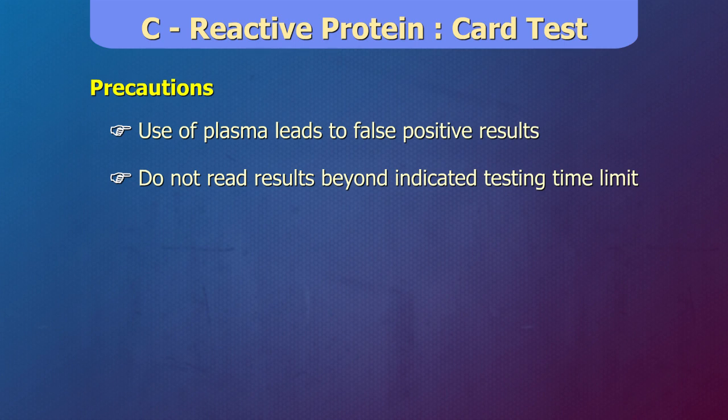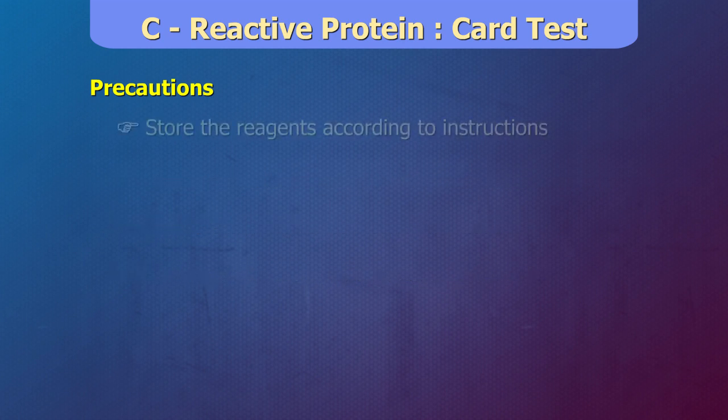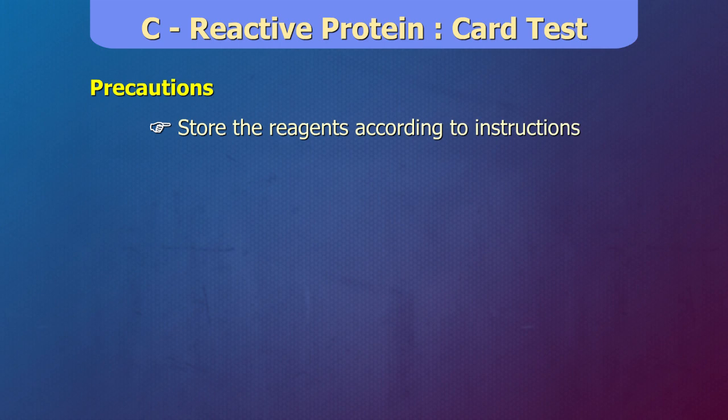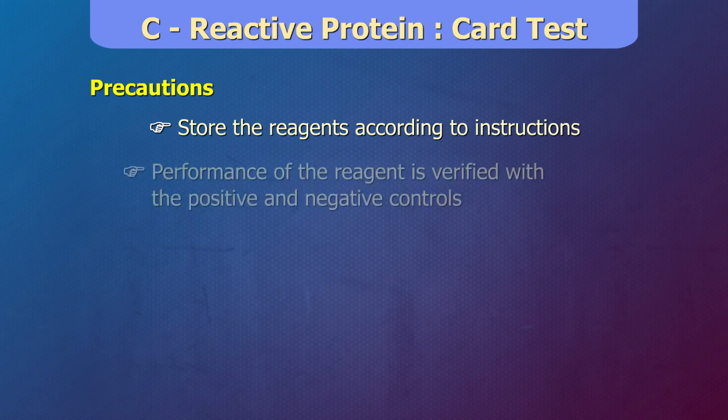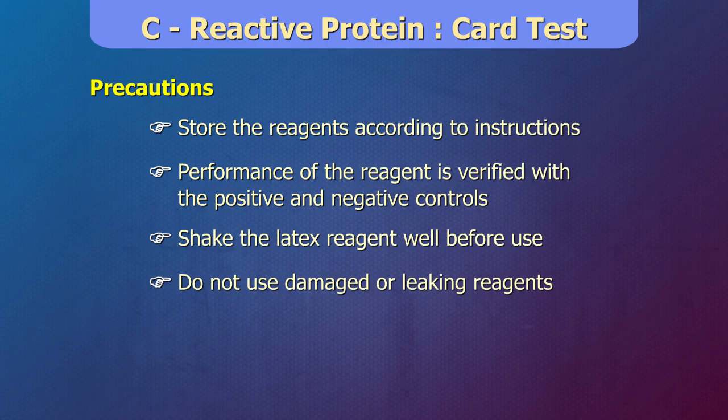The reagents contain 0.1% sodium azide as preservative. Avoid contact with skin and mucosa. On disposal, flush with large quantities of water. Store the reagents according to manufacturer's instructions. Performance of the reagent must be verified with the positive and negative controls provided with the kit. Shake the latex reagent well before use. Do not use damaged or leaking reagents.